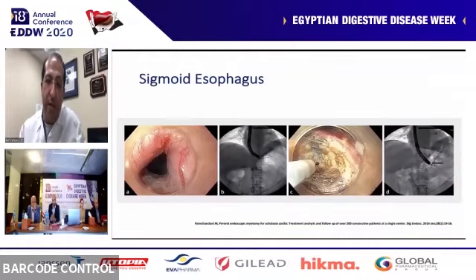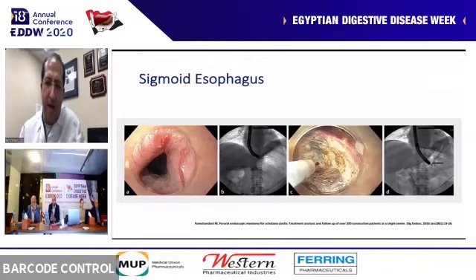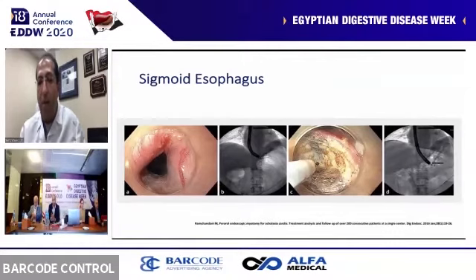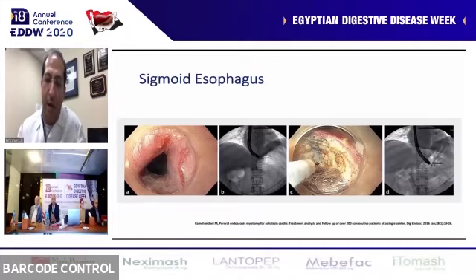Be careful with sigmoid esophagus. Nagy Reddy from India and some of his colleagues spoke about using endoscopic landmarks through fluoroscopy in sigmoid esophagus, because again, a lot of times, as you can see in picture B, the scope can make a turn and might not follow the normal anatomical line. These are small case series. A lot of it is good information, good techniques, but fluoro is never really adopted as necessary for peroral endoscopic myotomy.